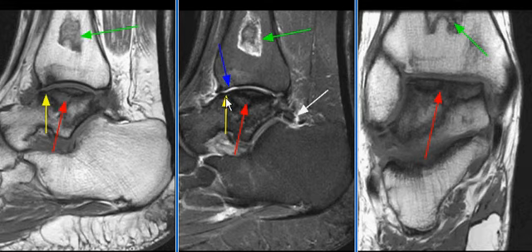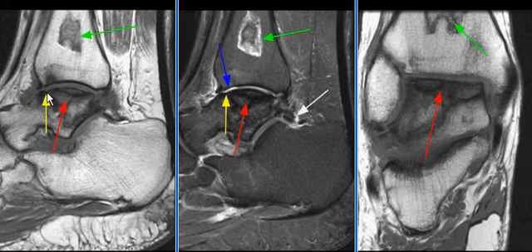There is mild flattening of the talar dome with a focus of subchondral collapse anteriorly, as seen on this image with the yellow arrow, as well as posteriorly.